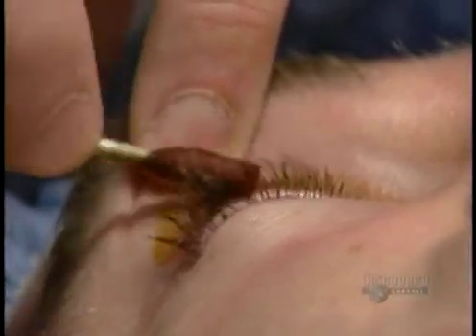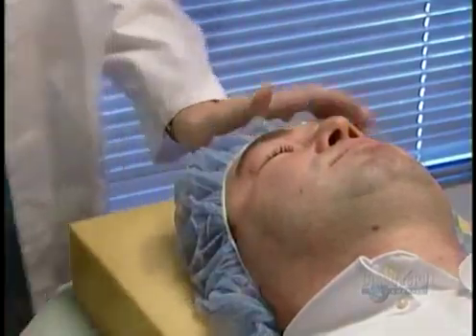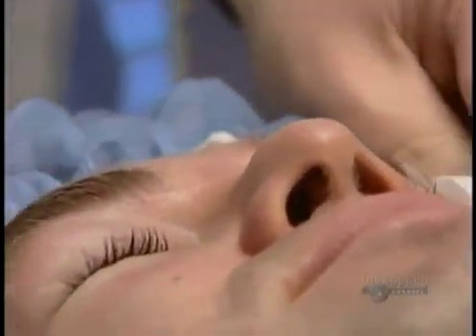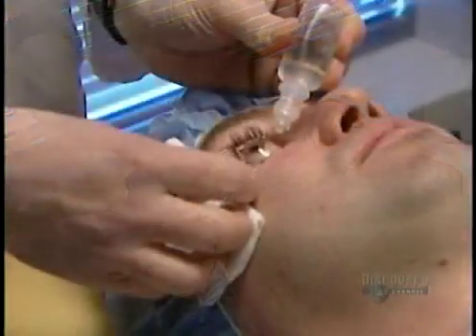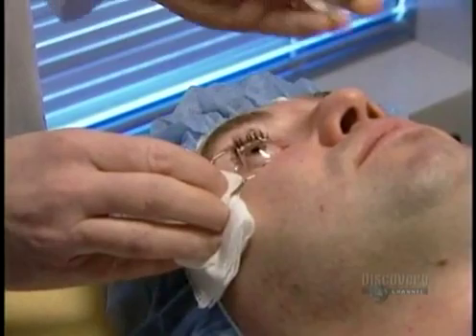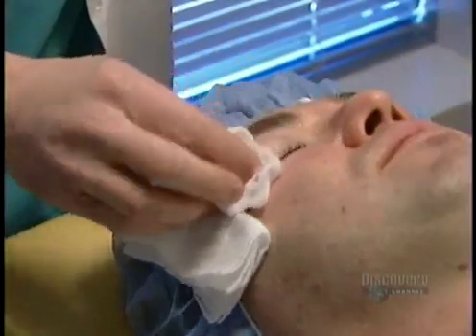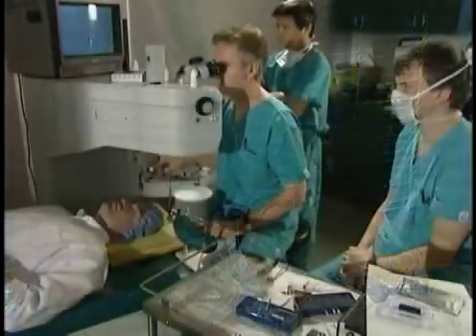The surgeon operates on one eye at a time. He cleans the eye, the lid and the lashes with antiseptic, and administers anesthetic drops to freeze the eye and lid. He opens the lid wide with a speculum, then rinses the eye with a saline solution. Everything's frozen so the patient doesn't feel a thing. Next, antibiotic drops to prevent infection.